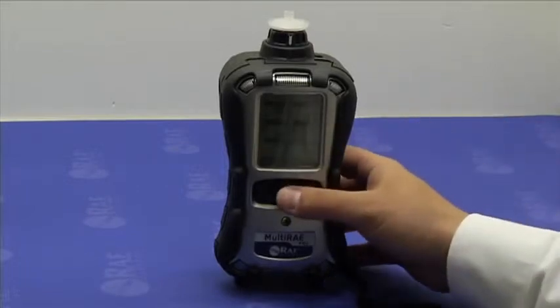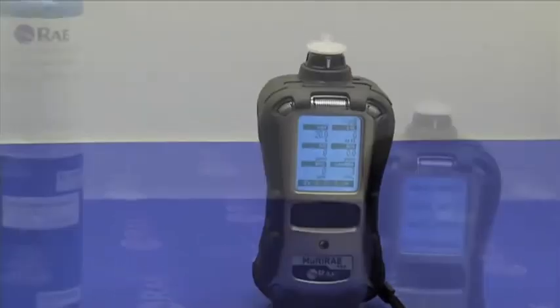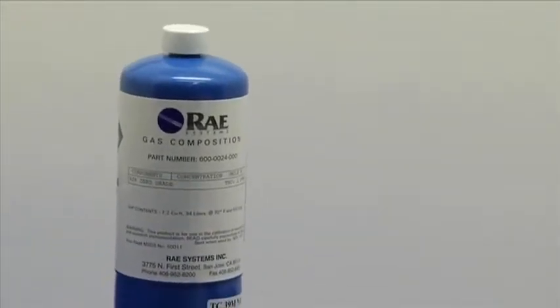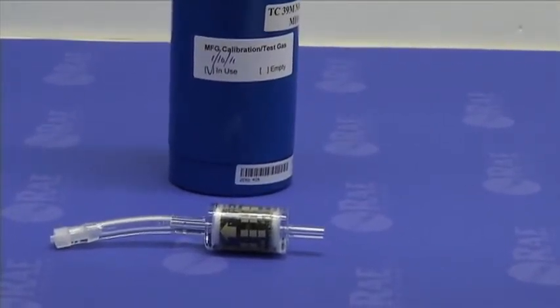If the ambient air is not clean, you can use the zero grade air cylinder or dry air, and the charcoal filter to eliminate hydrocarbons.